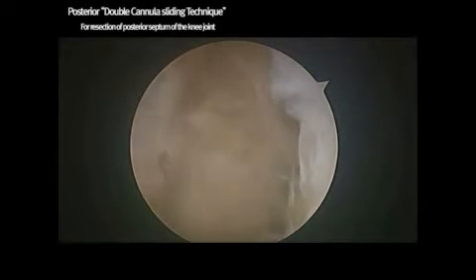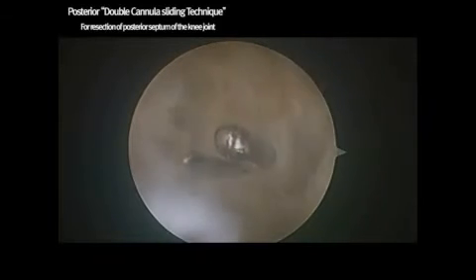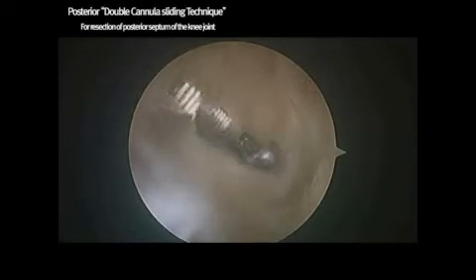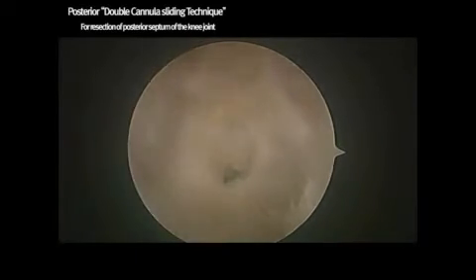After identifying the posterior-medial soft spot by finger tapping, an 18-gauge spinal needle is subsequently inserted in the posterior aspect of the medial femoral condyle 5 mm behind, parallelly. After capsular enlargement with a hemostat, insert a transparent cannula, 5.75 mm.